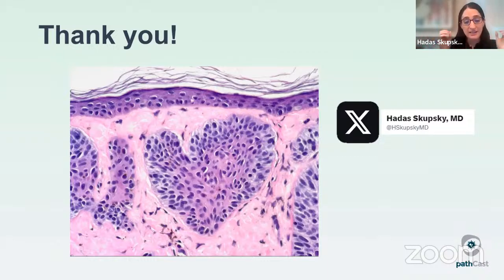However, a lymphocyte in the epidermis does not necessarily mean lymphoma. So it does not mean CTCL, mycosis fungoides. You can definitely have lymphocytes in the epidermis in non-lymphoma pathologic states. Spongiotic dermatitis will always have some lymphocytes. But again, the main way to know, am I dealing with lymphoma here, epidermotropism versus just exocytosis of lymphocytes in spongiosis, is there significant spongiosis there, right?